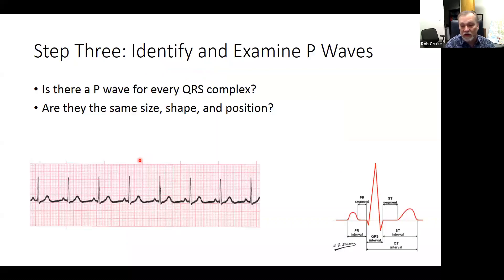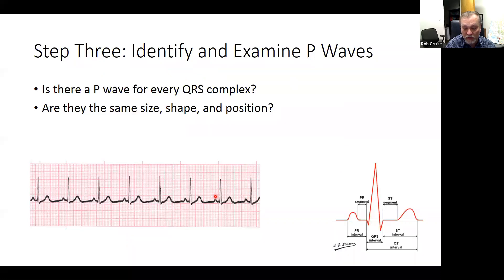Step three: identify and examine the P waves. Before each QRS complex, is there a P wave? Looking across the strip — P wave here, P wave here, P wave here — yes, yes, yes, yes, and yes. So we have P waves, and we check that off on our list.